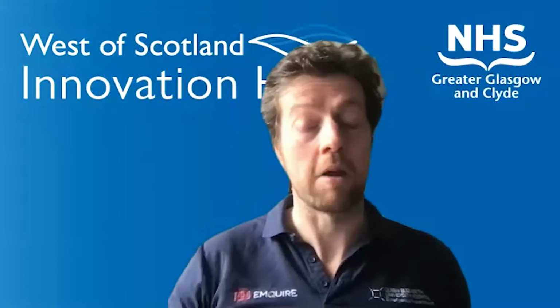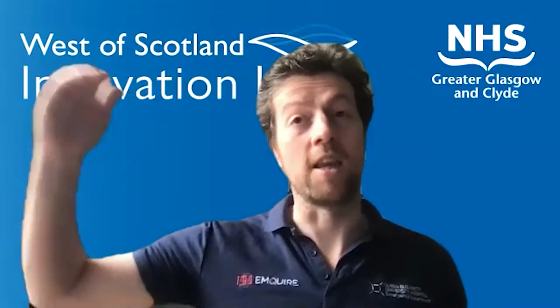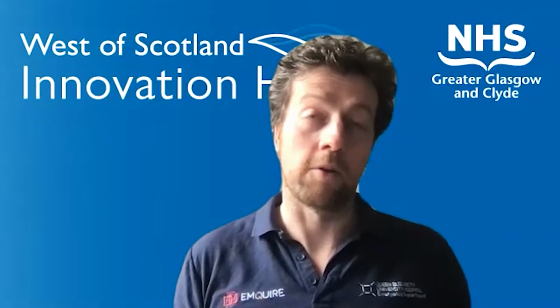And while a chest x-ray remains a mainstay of the investigation, it perhaps is not as high up the differential diagnosis for clinicians, and it's really a way of just re-highlighting that actually this x-ray could potentially be COVID, and for people to engage with that particular aspect of the patient's presentation.